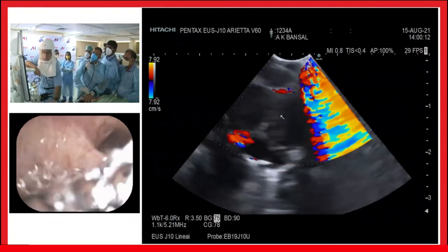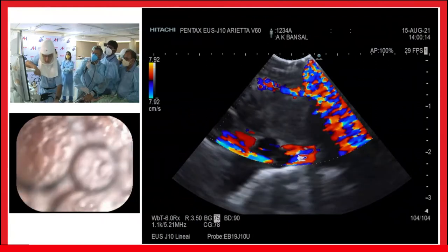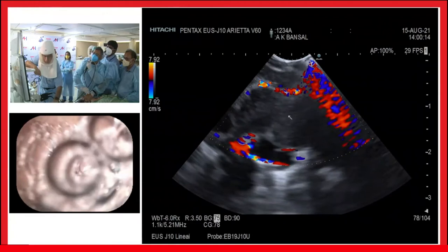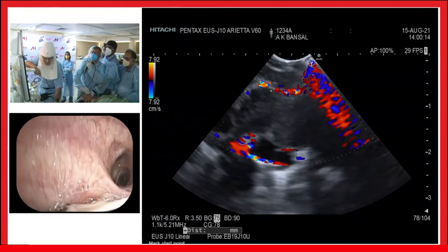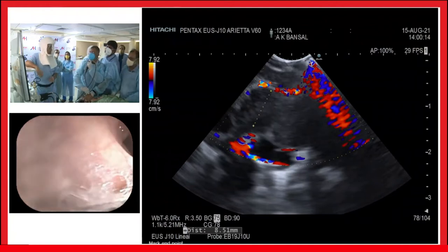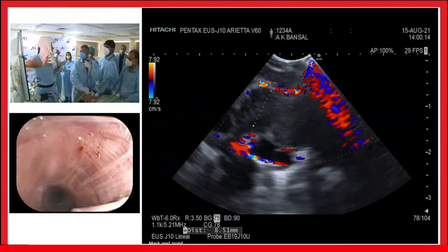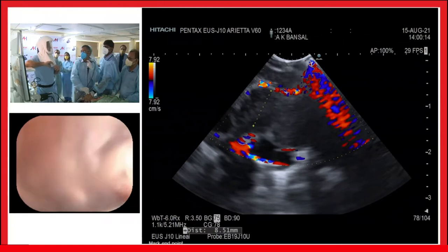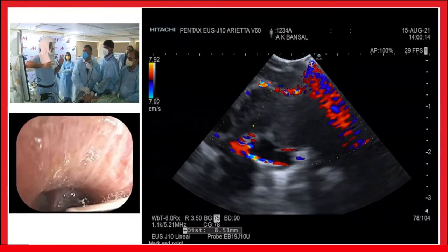So usually you can see that there is a lymph node which is small. Do you think it's malignant, sir? I would say benign. Because even I would like to give a small input. Sarcoidosis is an infiltrative disease. Yes, sir. Tuberculosis is a destructive disease. Sarcoid lymph nodes can enlarge. Tuberculosis lymph nodes, before enlarging, will liquefy.